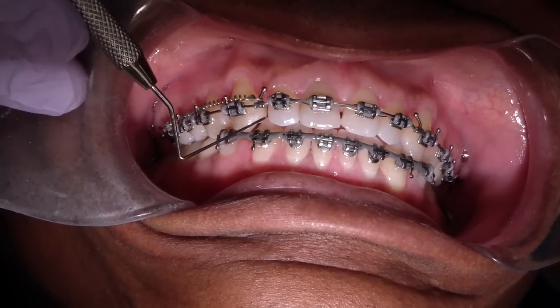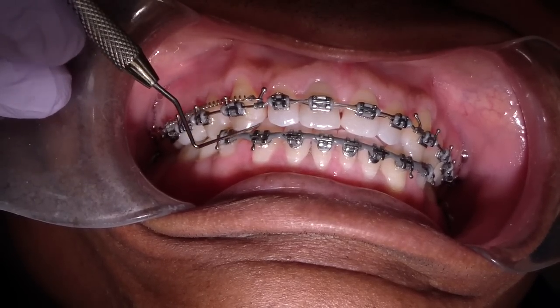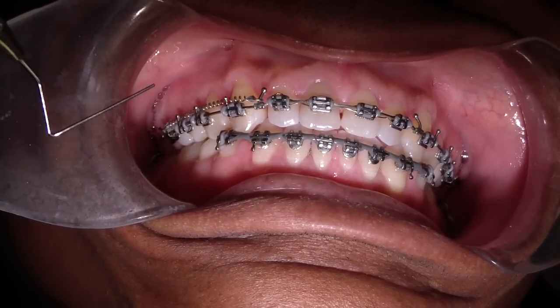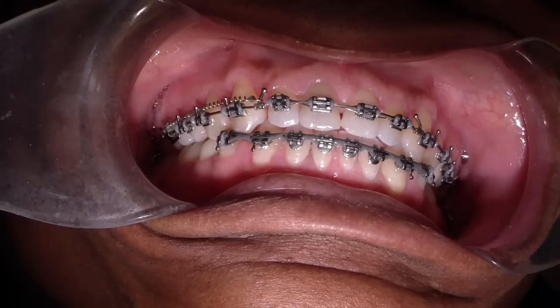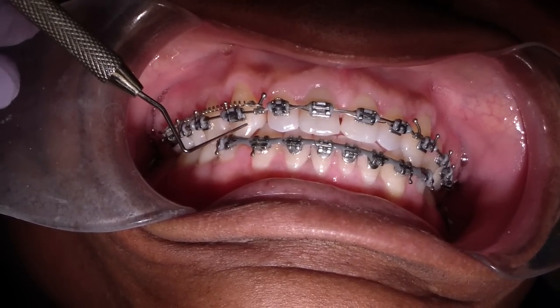We're also comparing that with the amount of overjet that we have. We're just about closed. And he said for the first time ever he's contacting his canines, so it was a unique feeling.